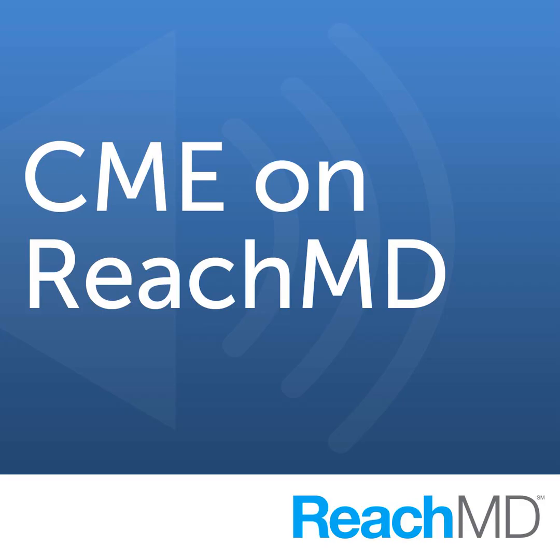On the other hand, we got a new experience. And what we are talking about is the following: not only based on echocardiography, but also using CMR, a certain phenotype, here indicated by late gadolinium enhancement, got a new role. And on the other hand, it's important for me to mention that it is not always the case that you have that pattern of late gadolinium enhancement; it may be there, but not necessarily.